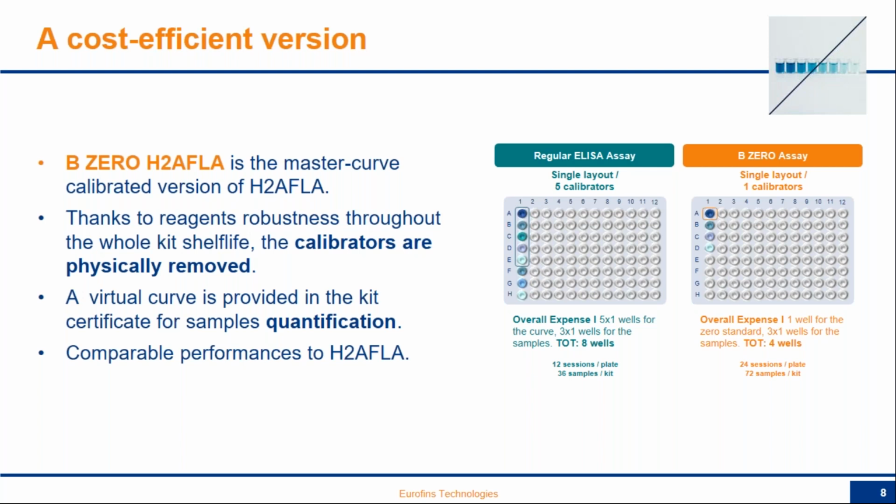Just to make my point very clear and very easy, if the assay is incubated, for instance, at a warmer temperature, both samples and curve will be affected. If the incubations are extended for any reason, like a mistake or some interruption to the analyst, again, both the samples and curve will. And the curve also has an important role as it allows analysts to check the session compliancy.